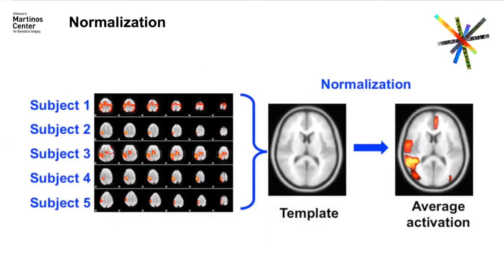Then if you do a group analysis, you want to compare brain activity between different subjects. And different subjects have different sizes and shapes of the head.